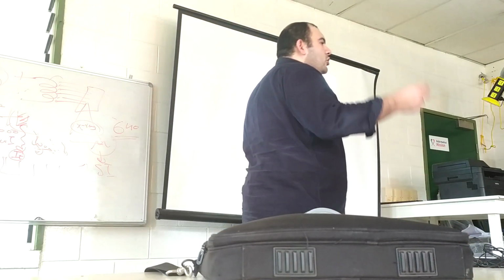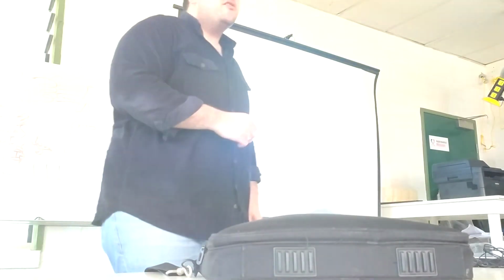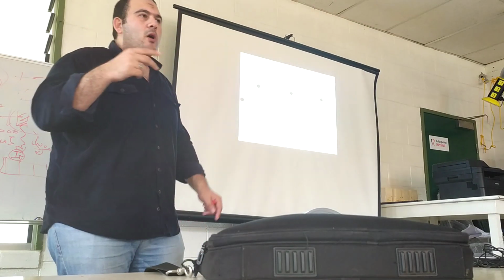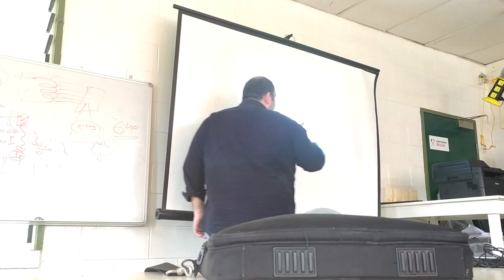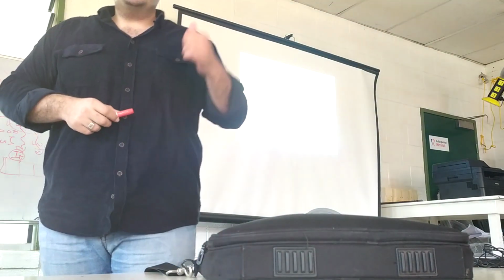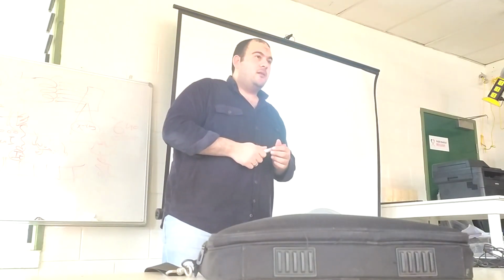Sometimes using 2 X-ray tubes, not 1, is called dual energy. Dual energy CT is a technology using 2 X-ray tubes, or using 1 X-ray tube with 2 different rows of detectors, each specific for a certain kV. This is very important in some applications like angiogram, using subtraction or this technique to subtract some image.